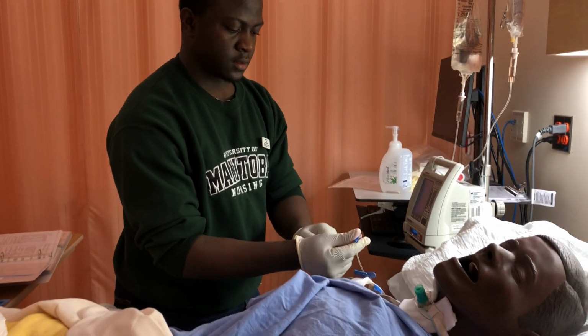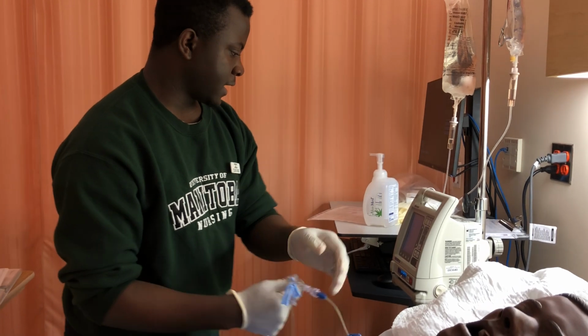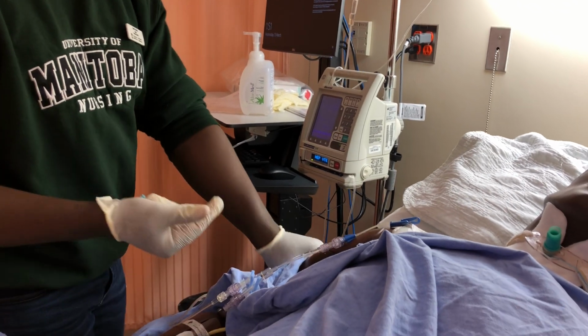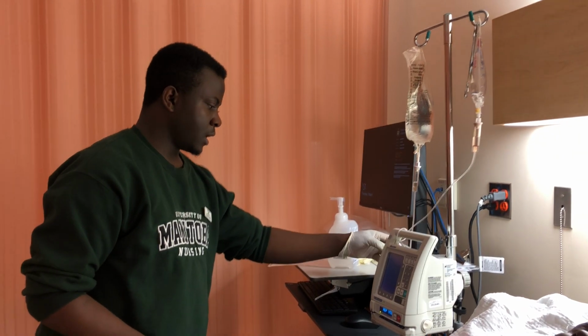Once I connect that, I should press start to start my heparin, and I'll just do all the patient teaching. I'll just watch to see that it starts to go between 80 and 120 drops, which it says. I'm just going to turn off the sound for the sake of the video, and I'm going to put it in my slot.